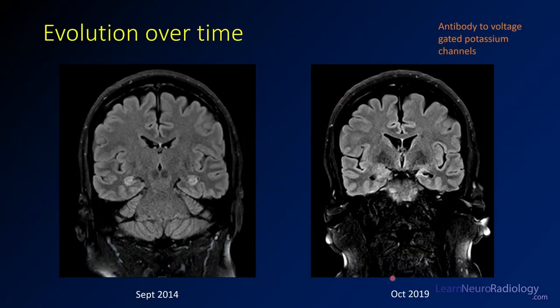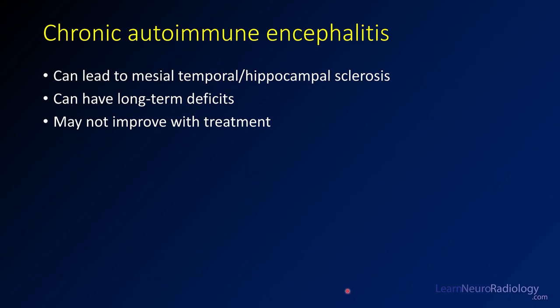This is how it has evolved over time for this patient. In September of 2014, the hippocampi were just bilaterally bright and kind of swollen. Within five years, you see a lot of atrophy with continued T2 hyperintensity. This patient had an antibody to voltage-gated potassium channels, which is why they were having chronic encephalitis, and over time they've lost nearly their entire hippocampal volume. Chronic autoimmune encephalitis, as in this case, can lead to mesial temporal hippocampal sclerosis, and patients can have long-term sequelae and may not improve with treatment.